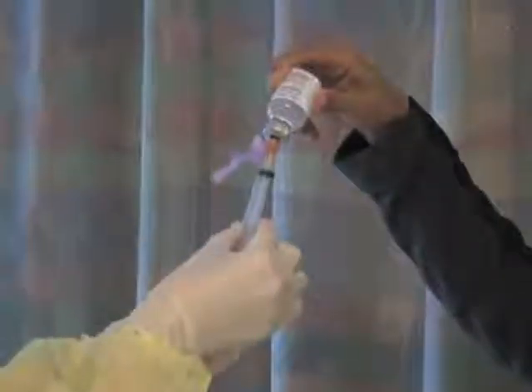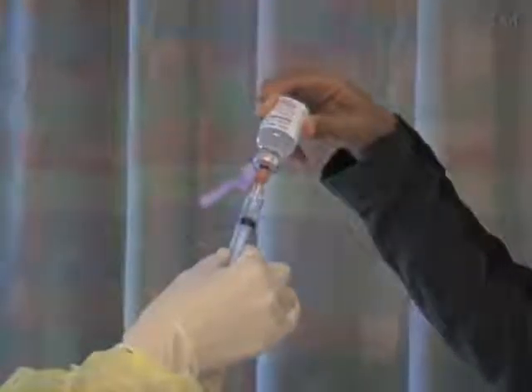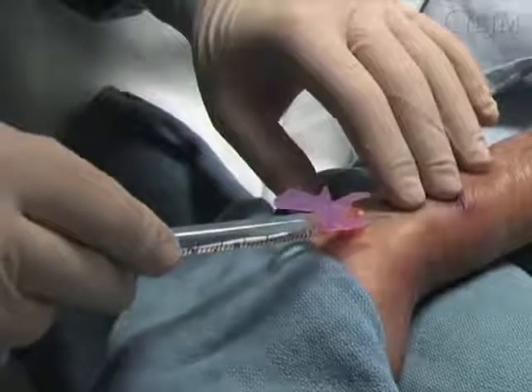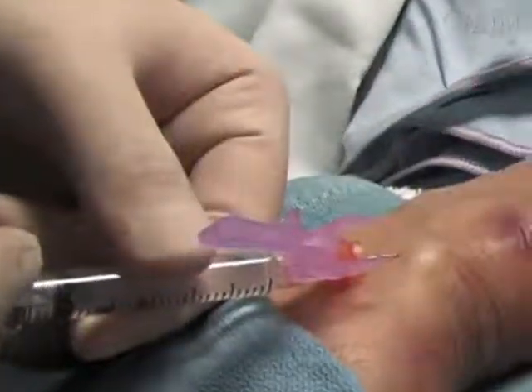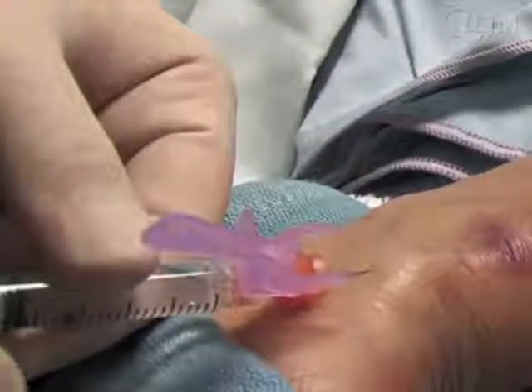Using the 5 cc syringe and small needle, draw up 1% lidocaine. Upon introducing the needle under the skin, draw back on the plunger to ensure that you have not punctured a vessel. Inject a small wheel of analgesic around the artery and wait 30 to 60 seconds for the lidocaine to take effect.